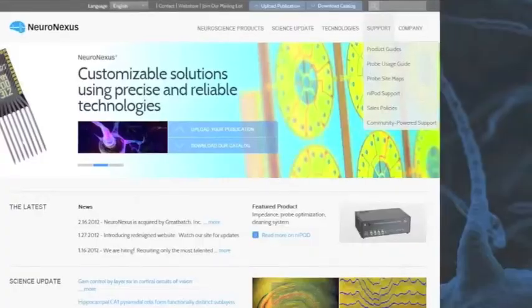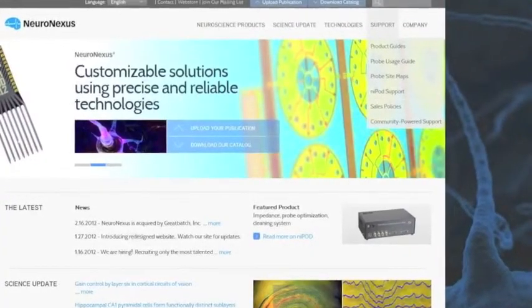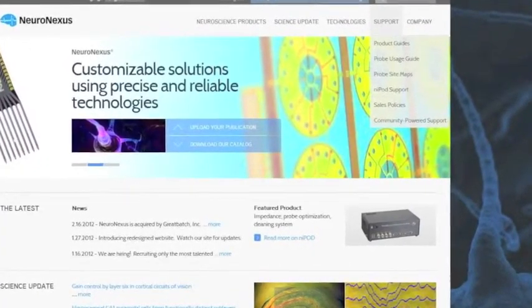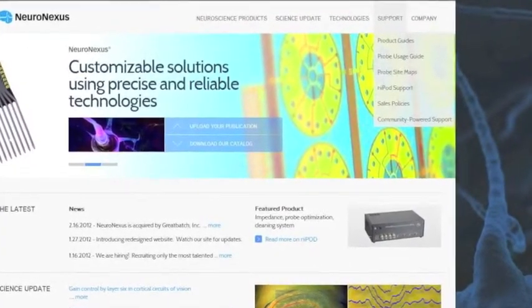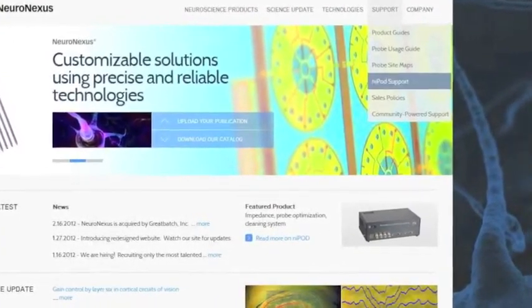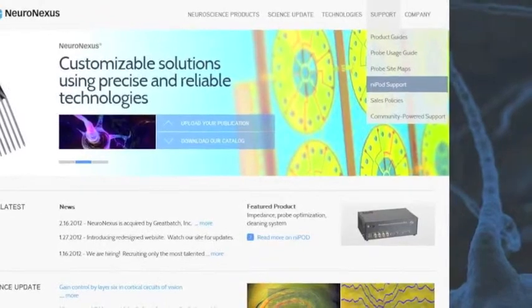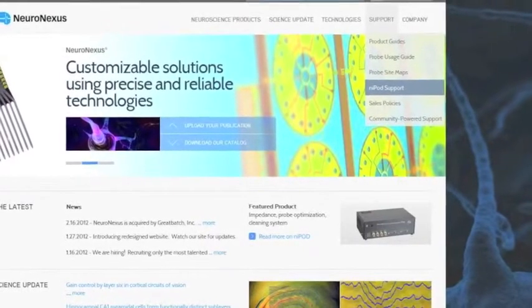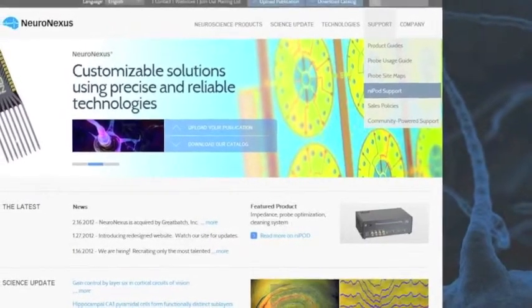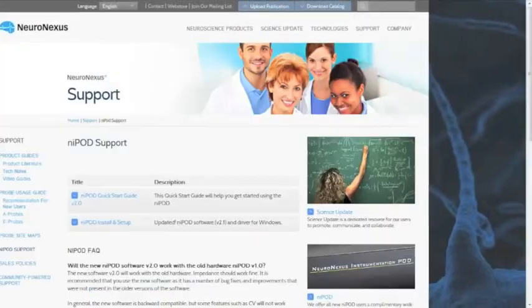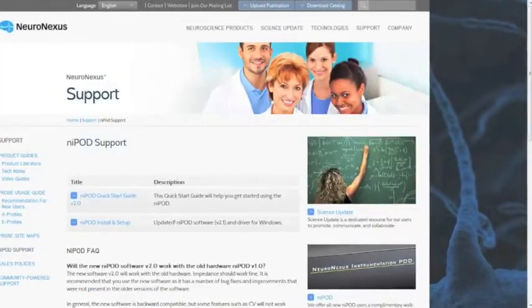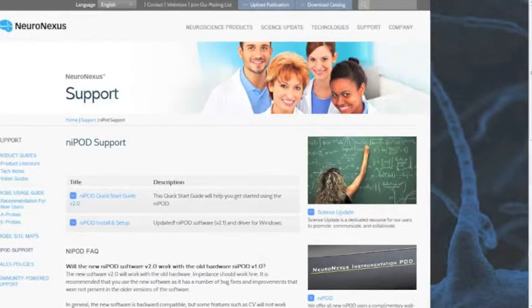Now we are going to teach you how to use the software. Go to the NeuroNexus website and under the support tab is a link for Nipod support.